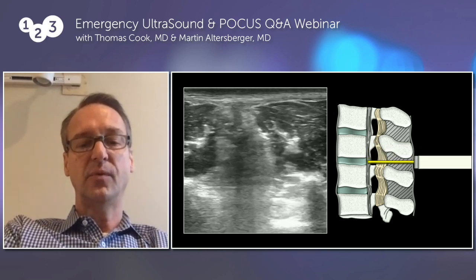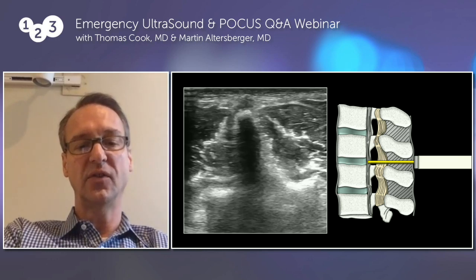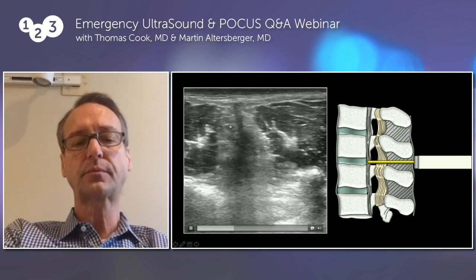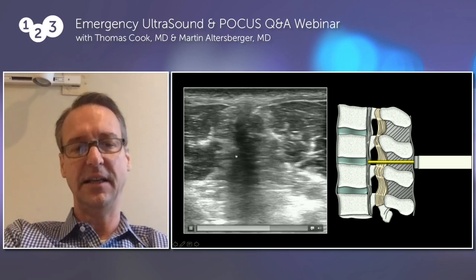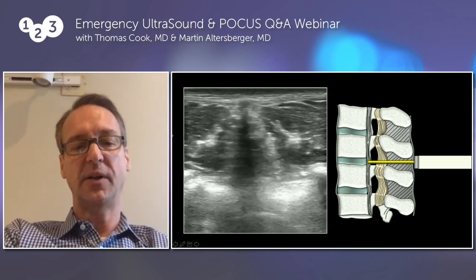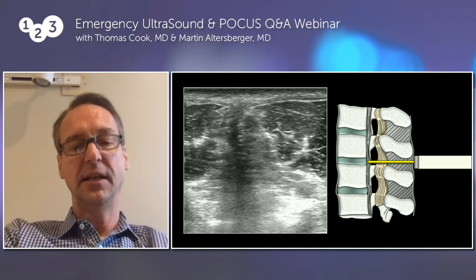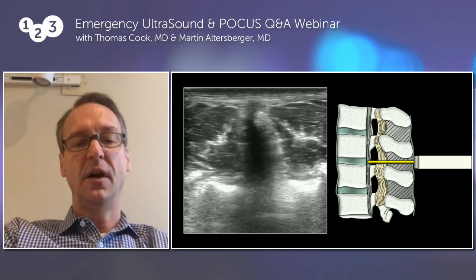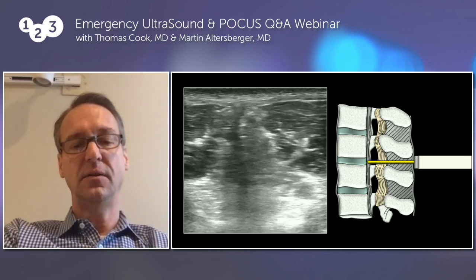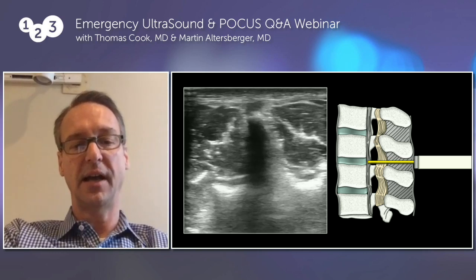The next tip is when you find that spinous process, you're going to lower the transducer so the tip goes away on the screen. That tells you that you are, in fact, in the interspace where you can put the needle into the skin and you will not hit the spinous process, and you'll be able to take that needle and place it into the spinal column. So that's the area you need to figure out how to mark or identify when you go back to actually do the procedure.